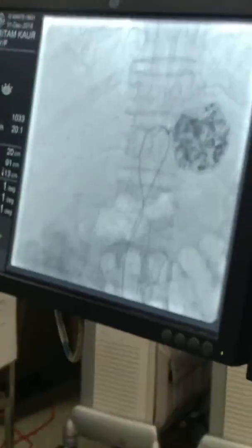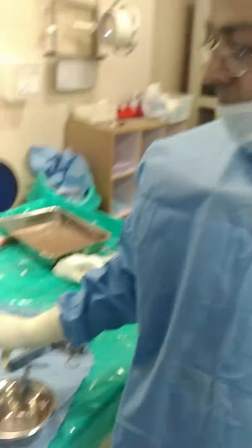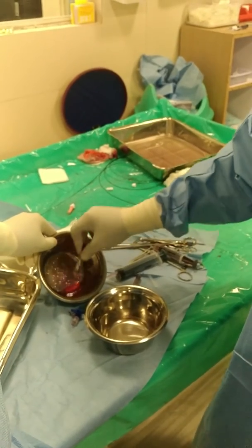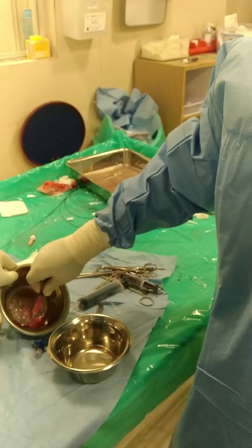I am removing the micro catheter slowly. It has some PVA but not too much of it. I am just coming into the common hepatic — not right hepatic, since right is arising from the SMA. Chemoembolization is a procedure learned by practice and experience, and everybody individualizes it for the patient and for themselves.